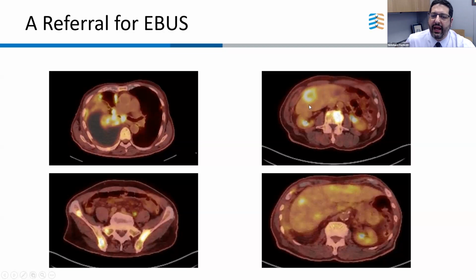And in this one, I have 2 slices through the liver showing, again, part of your decision making. Sometimes you get the sense something's necrotic. See, there's no uptake in the middle here. So sometimes you're tempted to biopsy something bigger when maybe something smaller would give you more material. So these are the kind of decisions you might have to make.